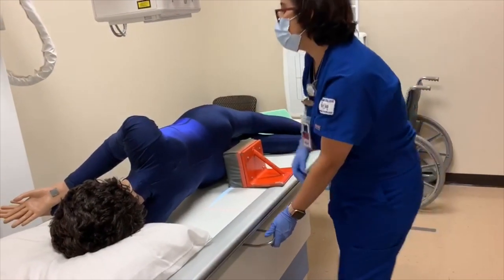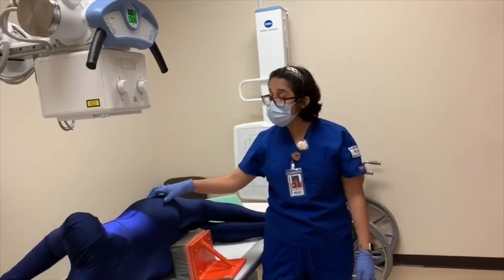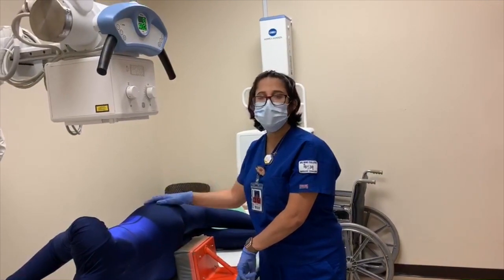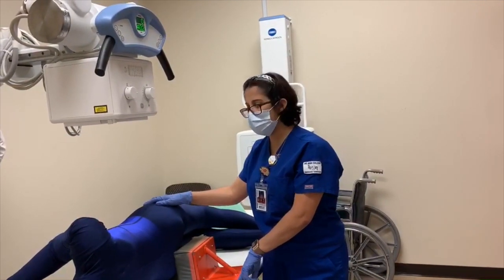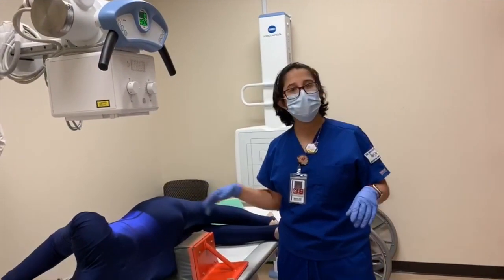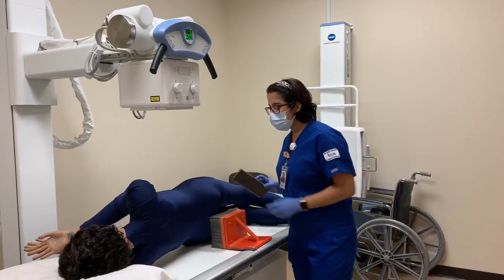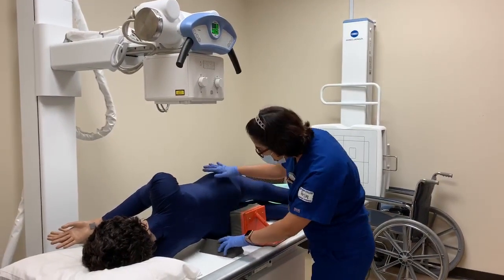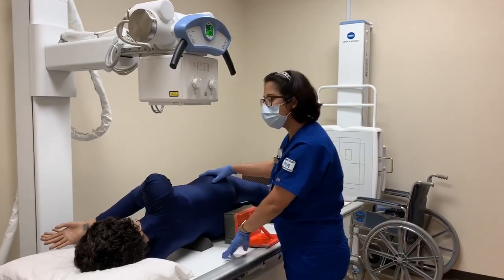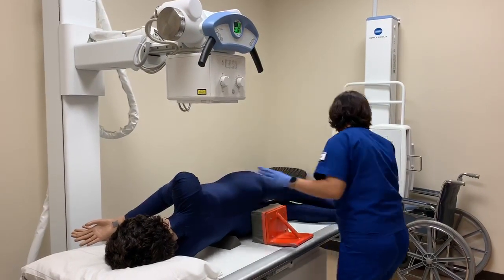And for this, we have a breathing technique, the orthostatic breathing technique. So you do a 2 to 3 second long hold, and you just have them breathe in and out throughout it. That way you can blur out the lung markings and the rib markings. Before we begin the exposure, we're just going to slide under a sponge to help support the patient's waist while also providing uniform density across the image.